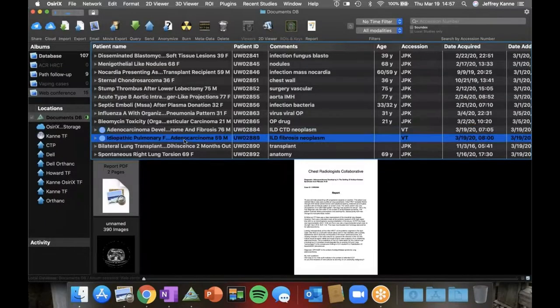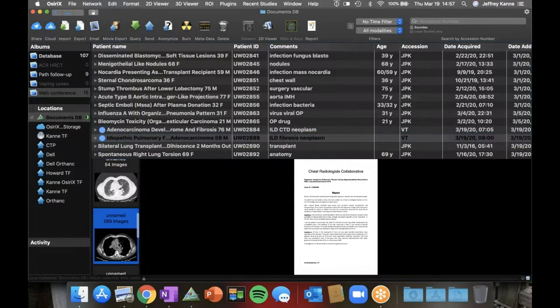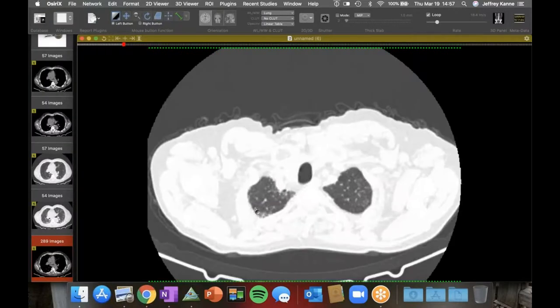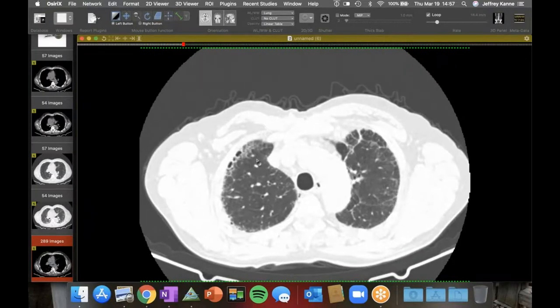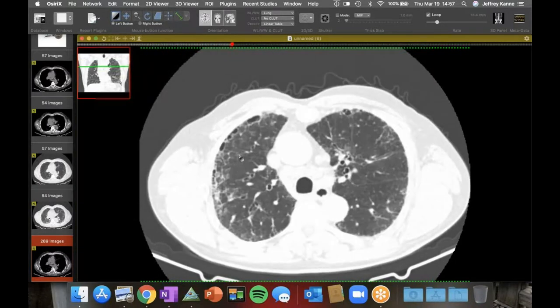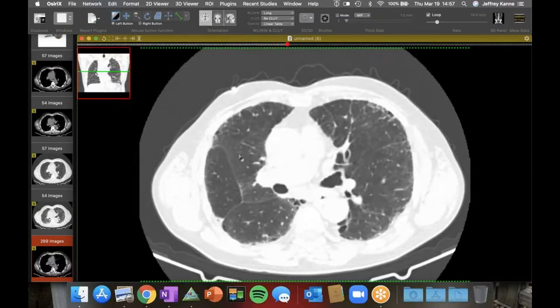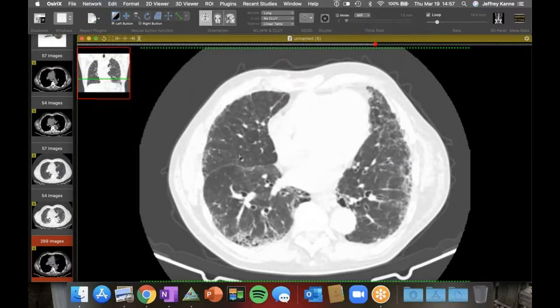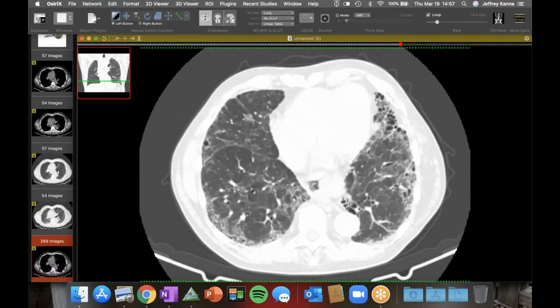And then here's a companion case and another sort of two questions. This is a nice case. Let's see if we find the thinner cuts. So this patient also has a diffuse lung disease. And if you look at it, you see it's predominantly subpleural. There's a single row of cystic spaces, maybe emphysema, maybe honeycombing, probably both. It's clearly basal predominant. And then in the background, though, I think there's a little too much ground glass opacity and there's some subtle mosaic attenuation.